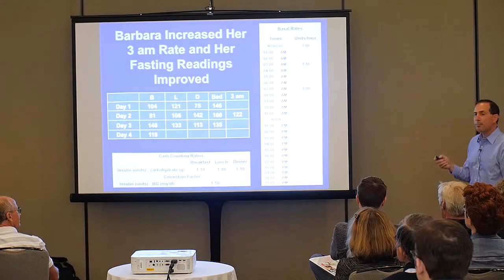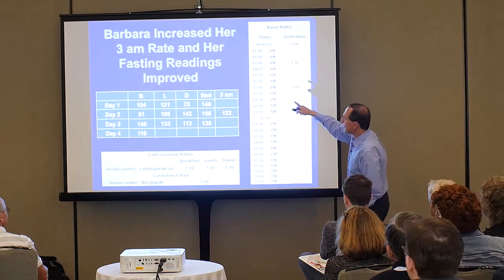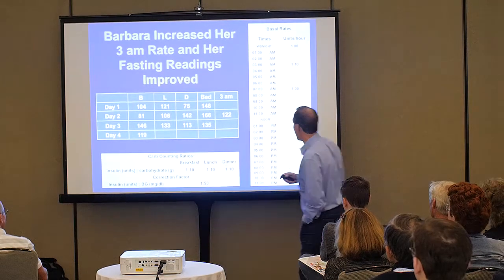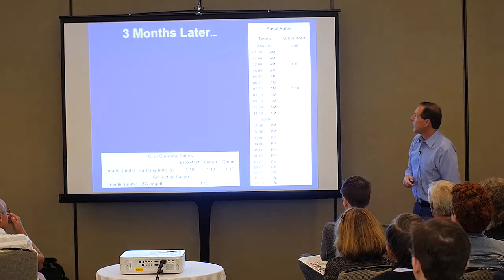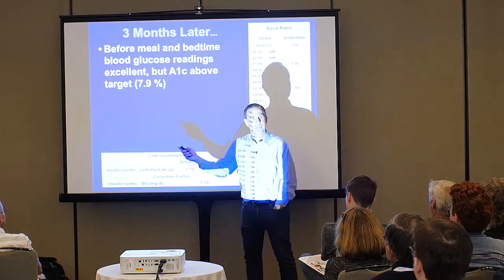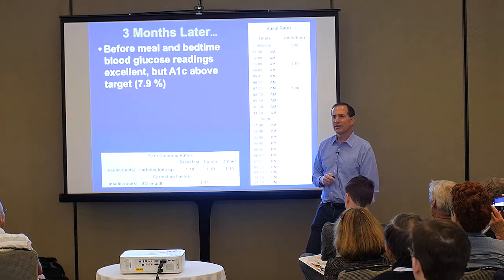Okay, so you helped Barbara because you were an excellent endocrinologist and you increased her 3 AM basal rate and her fasting readings are now a lot better. Congratulations, you did a great job. So now at 3 AM, she's 1.1. Okay, we're going forward now 3 months. Her before meal and bedtime readings are great, but her A1C is too high. Why do you think that is?